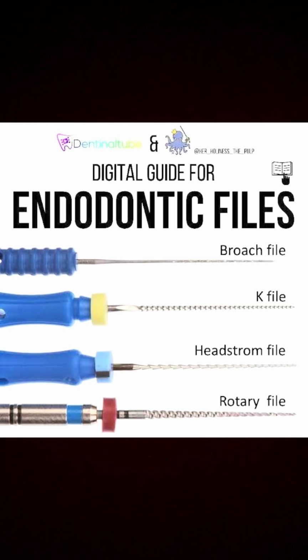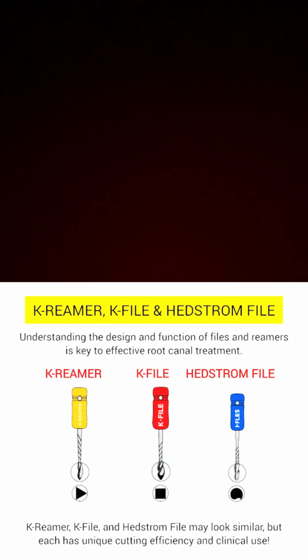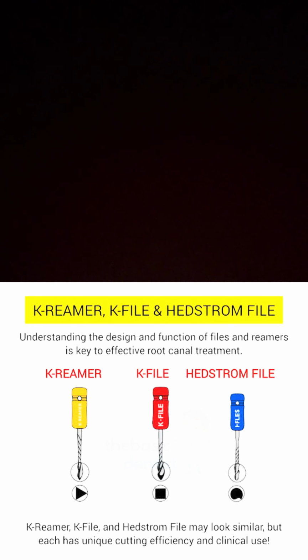Reamers manufactured from a triangular blank and files manufactured from a square blank are still made by a few companies. Clinically, files and reamers are recommended to be used in penetration, rotation, and retraction motion. File can also be employed in a filing or a rasping motion once canal patency is achieved. Files are manufactured from blanks twisted to produce tighter flutes, and reamers are manufactured with looser flutes.